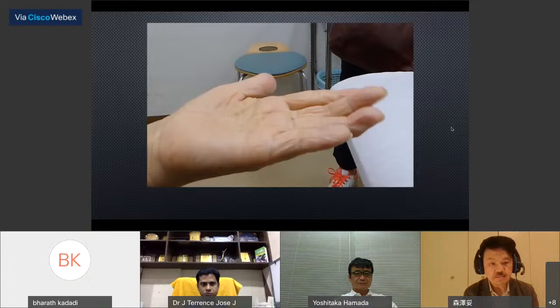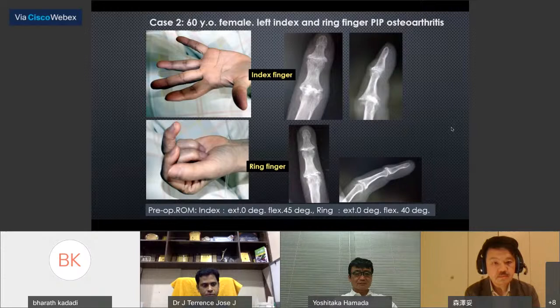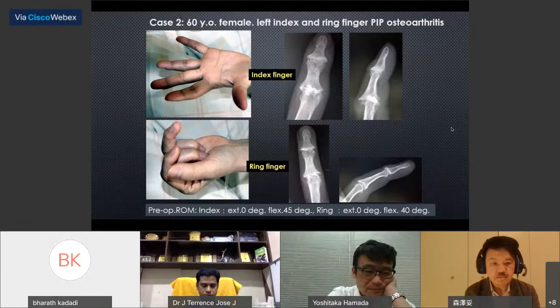This is case 2. 60 years old female, left index finger and ring finger, PIP arthritis. She has severe pain on motion, and as to X-ray of the index finger, severe OA. Proximal phalanx head was impacted. Total finger joint arthroplasty of the two fingers was performed simultaneously.